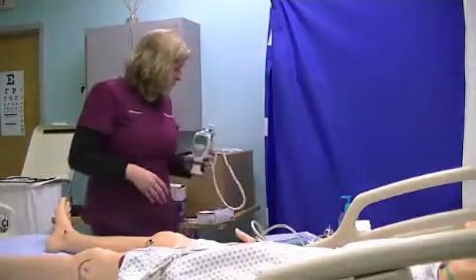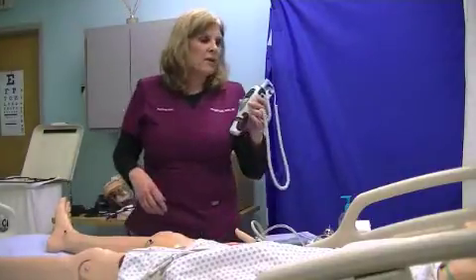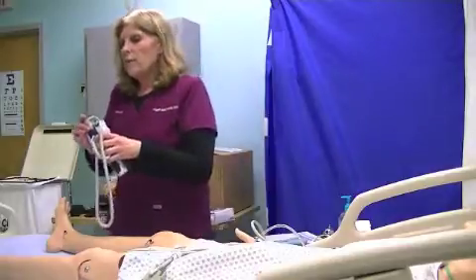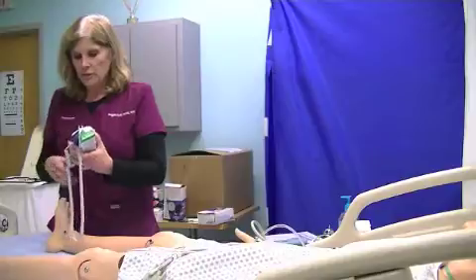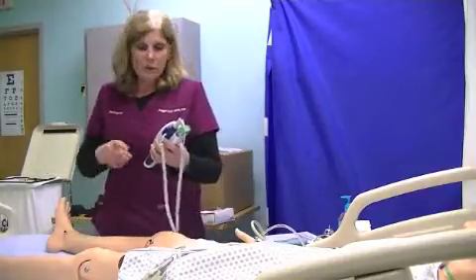Okay, when I go to take the temperature, I'm going to use different thermometers. I'm going to select the correct thermometer for the type. This particular thermometer has a blue tip on it. This blue tip is actually to take an oral temperature or an axillary temperature. This is called a SureTemp. This is what the facility we're going to uses.